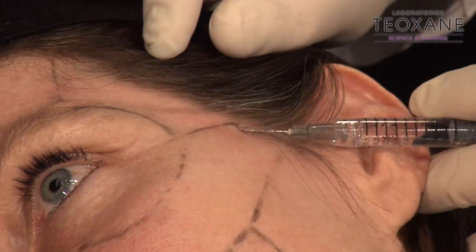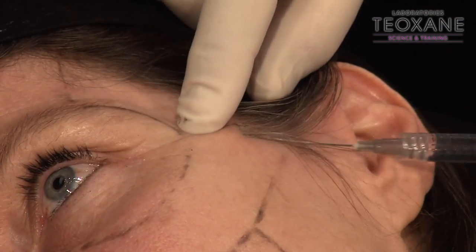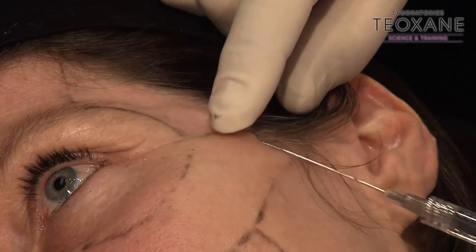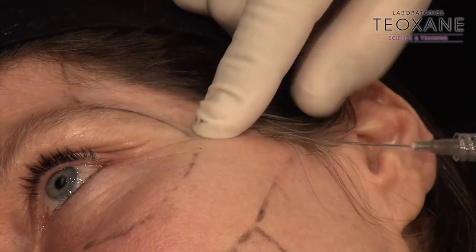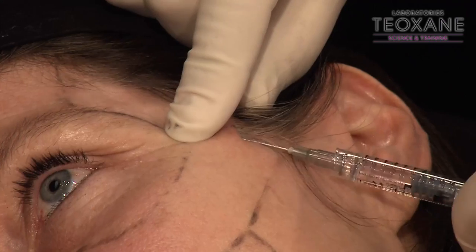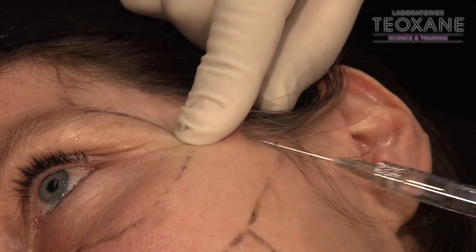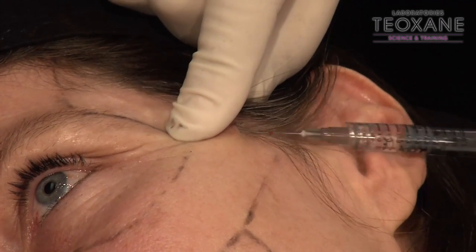Quick, above the eyebrow. I'm going to do a brow lift. And I feel the temporal area quite quickly. Fan technique. Bim, bim, bim. With Ultimate. Ultimate is great because Ultimate would last minimum 2 to 3 years in this area. So, lucky patient, she won't have to have this procedure too often.